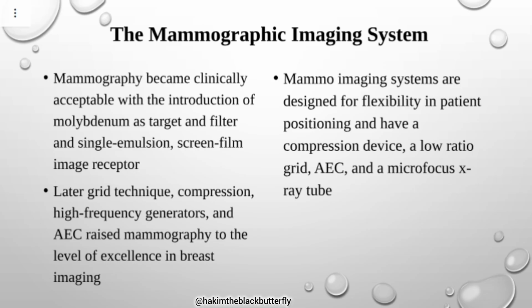Mammo machines have micro focus spots. One is 0.1 millimeter and another is 0.3 millimeters.